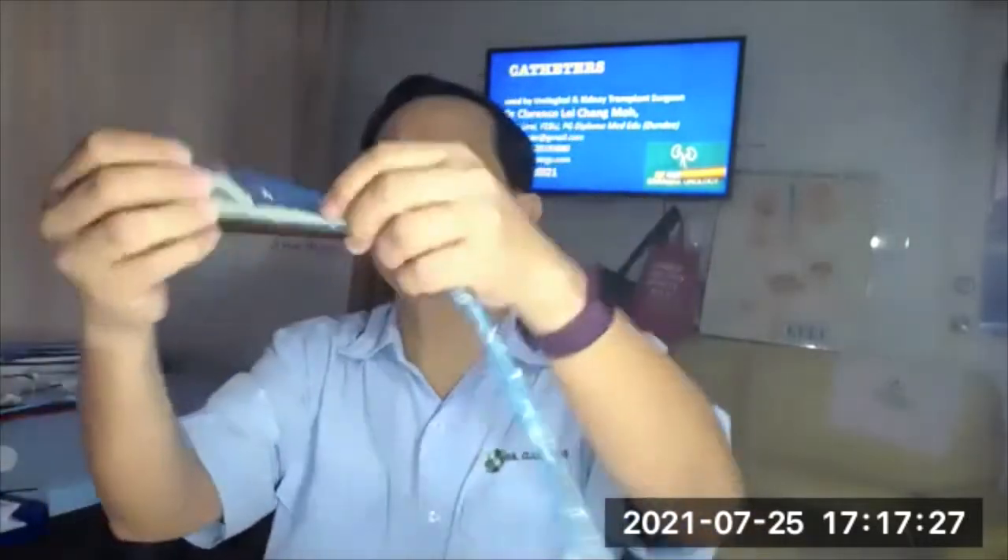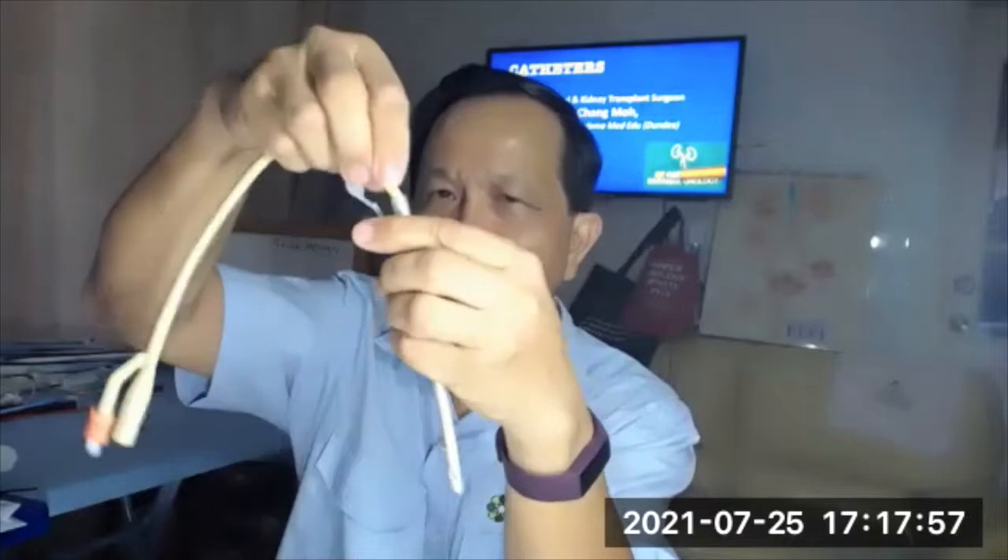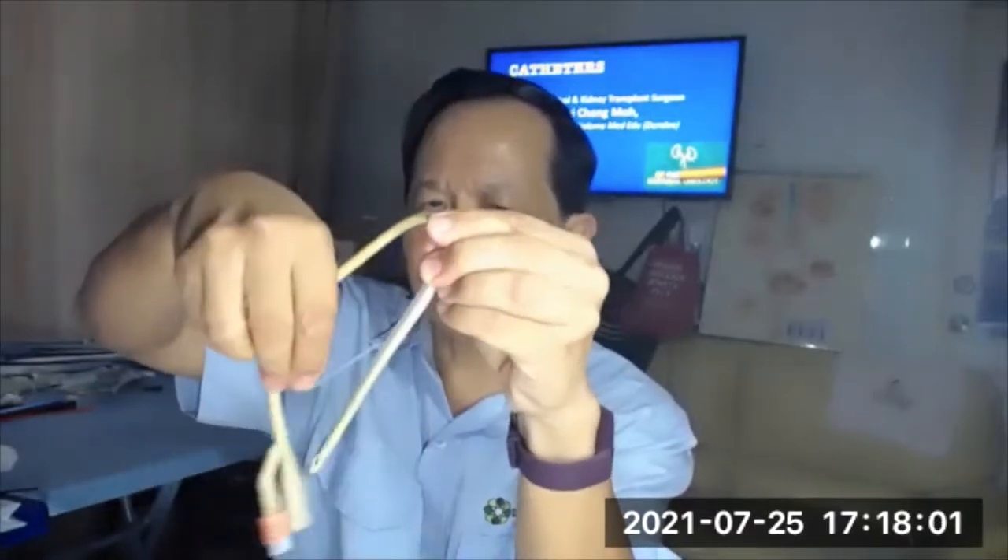The next catheter is the BART suprapubic catheter. It is quite a big catheter — size 16 — and it's a 4-flap catheter with a balloon. There's a large trocar which is very sharp. We insert it into the bladder, making sure the bladder is distended by ultrasound or by aspiration. Once inside, we take out the trocar, put in the catheter, and inflate the balloon. You then peel away the outer trocar. This is the BART suprapubic Foley's catheter, size 16. After two weeks you can easily change it. It's good for long-term drainage when the patient has a urethral stricture or urethral obstruction.